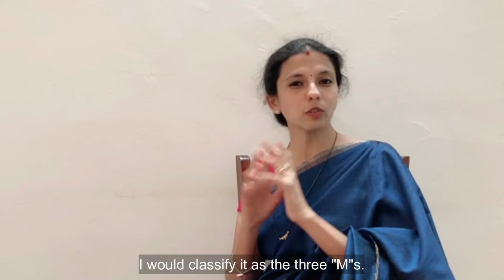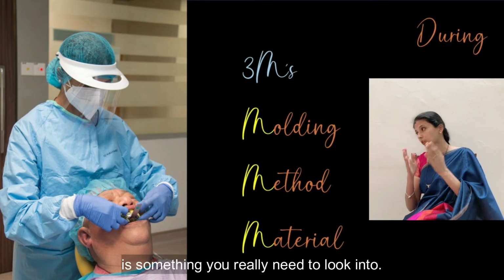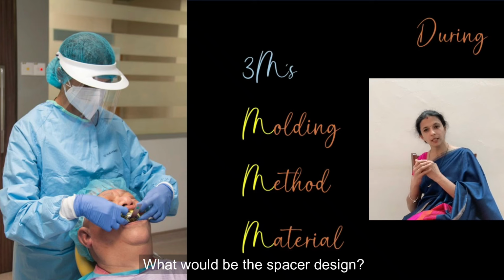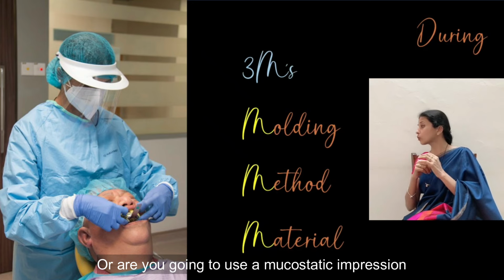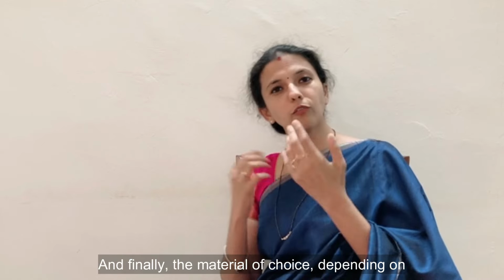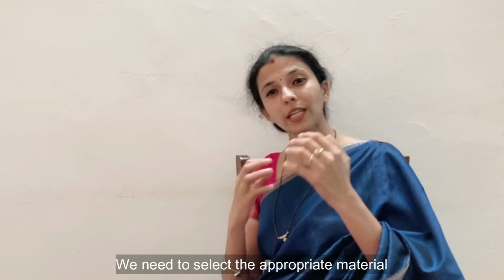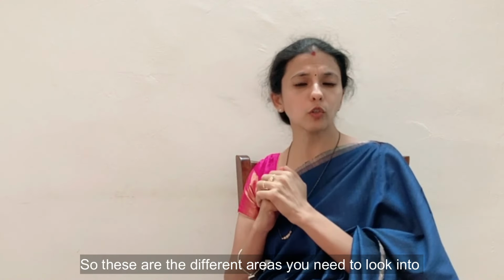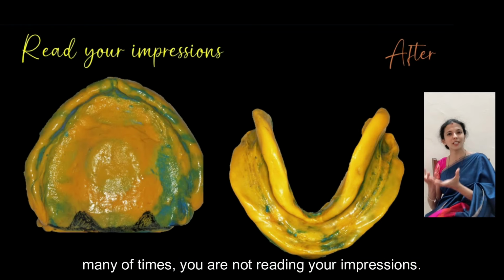Now during the impression making, I would classify it as the 3 M's. The moulding, that means functional manipulation of the tissues, is something you really need to look into. Second is the method, which type of impression technique, what would be the spacer design? Are you going to use a selective pressure where you are selectively going to load the tissues, or are you going to use a mucostatic impression where all the tissues will be relieved? So these are the decisions which you need to make. And finally, the material of choice. Depending on whether there are undercuts, what is the type of the tissue, we need to select the appropriate material for the individual case. So these are the different areas you need to look into during the impression making. Now after the impressions, many a times you are not reading your impressions.